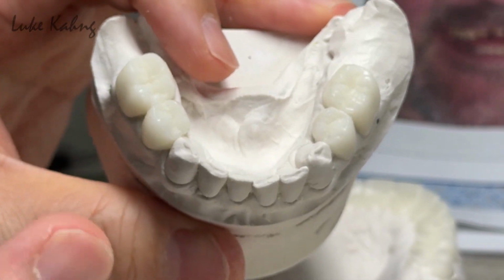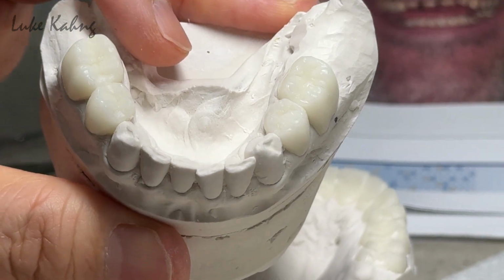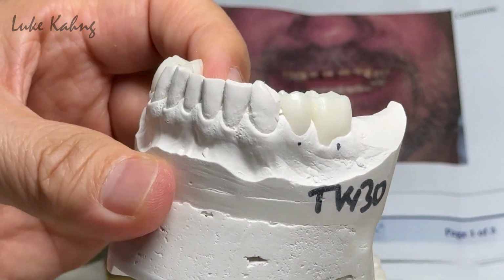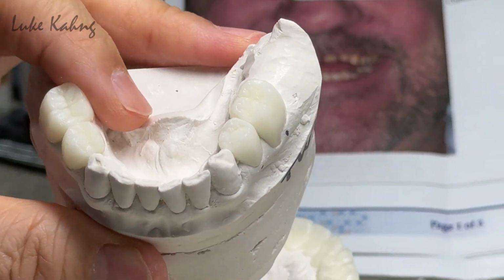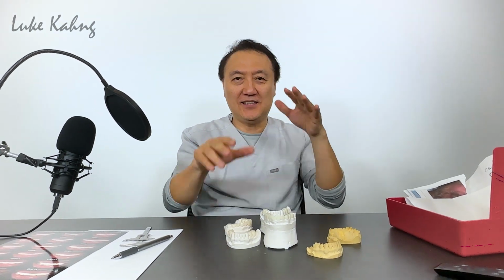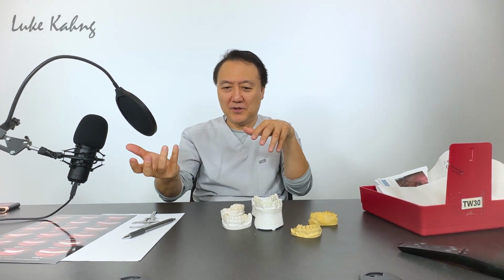All right, this stage is almost done. I would say 80% is done. All right, I'm going to show them later about the temporization, how I finish it. Anyways, whenever they put it in there, I saw his shape, so I made a kind of square shape. It's longer. For guidance, you can see my other video here. So I checked the guidance within a couple of minutes.